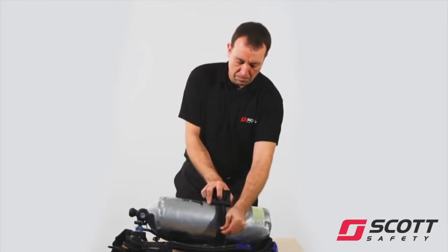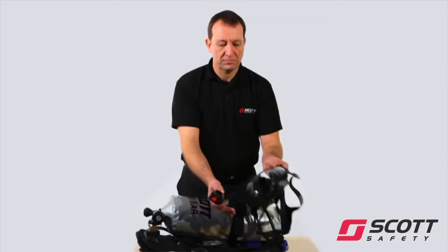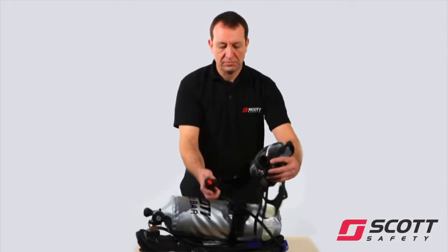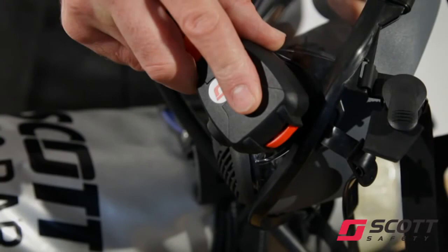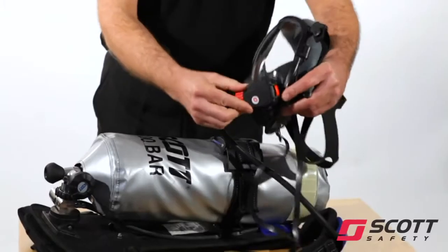Check the cylinder is secure. If not, tighten the band further. Connect the demand valve to the face mask and check that the red locking catch engages fully. Rotate the demand valve gently to confirm that it is engaged.